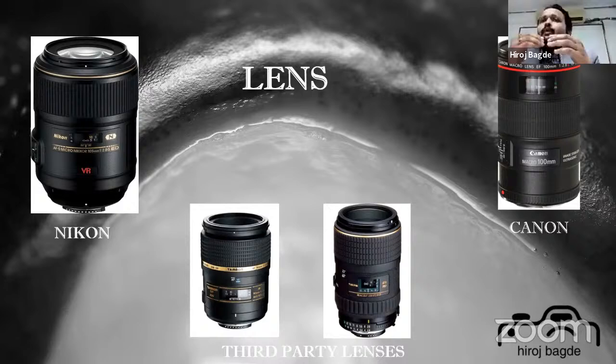So I have told you that f2.8 will give me a very narrow field. I don't want that. I want the f number to be higher. So I will go for those lenses which are macro, but which can also provide a very good amount of light, and which can go to maximum reduction in the f size or f number. So all these, Nikon 105 mm, Canon 100 mm. Now I myself have a Tamron lens.